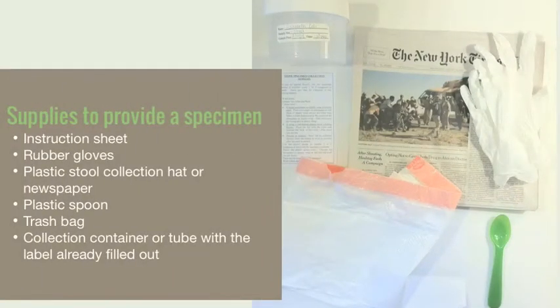Patients will need supplies to provide a specimen, including an instruction sheet, rubber gloves, a plastic stool collection hat or newspaper, plastic spoons, a trash bag to discard used supplies, and the appropriate collection container or tube with the label already filled out.